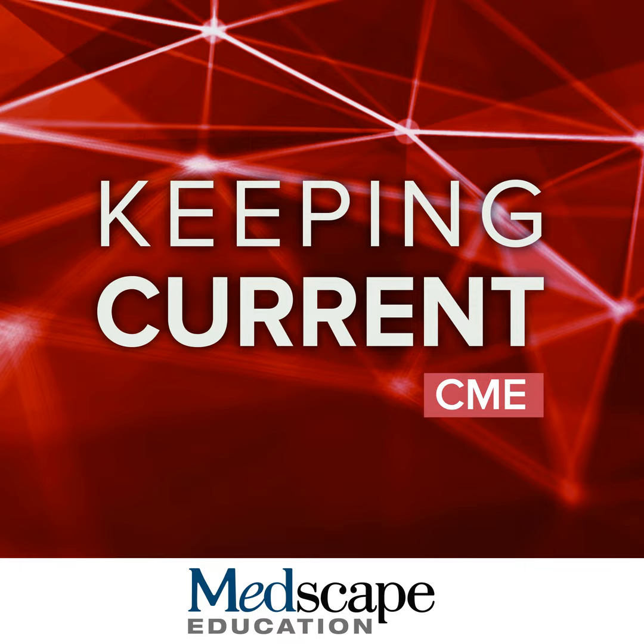And then finally, for amyloid PET, the key here is for these therapeutic decisions and for monitoring, it's very, very helpful to include that centiloid standardization, even at that baseline scan, because down the road, when they're looking at the response, it's helpful to know where they started.